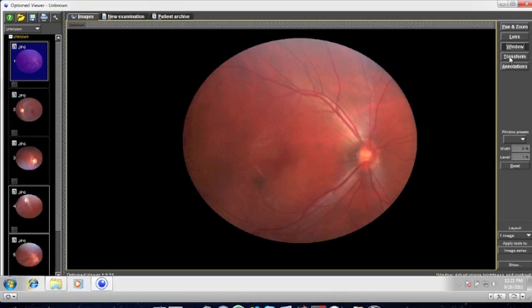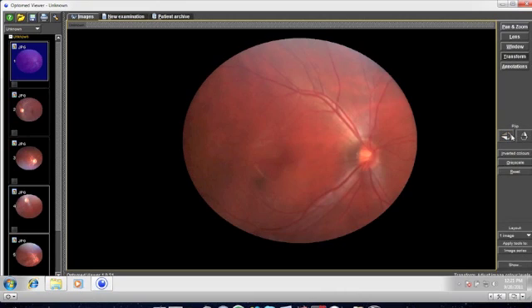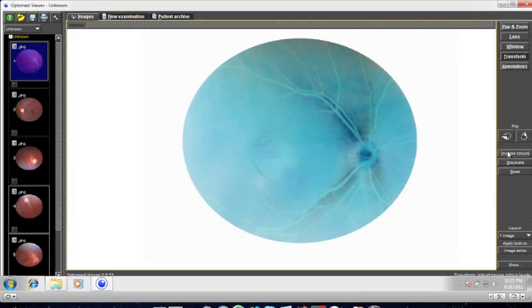The transformation tab allows you to change the colour scheme of the image. The image can be rotated 90 degrees by clicking on the flip buttons. You can also invert the colours or choose to view the image in black and white. To revert back to the original image, just click reset.